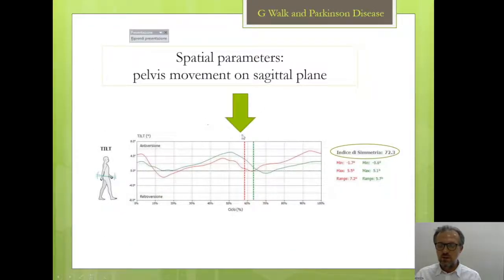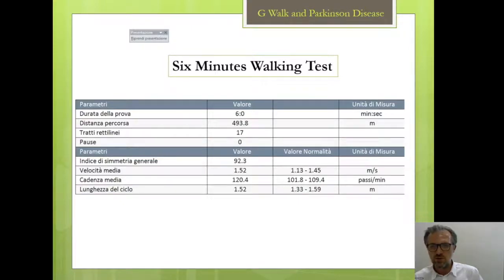We have a very low symmetry even on the sagittal plane in terms of pelvis movement, because we have 72%. We can perform this evaluation in the on or in the off phase, at the beginning or at the end of the rehabilitation process, with or without a certain type of shoes, if we want to evaluate whether a certain type of therapeutic intervention is providing an improvement in the performance of our patients.